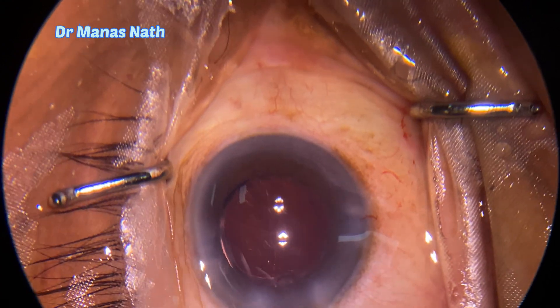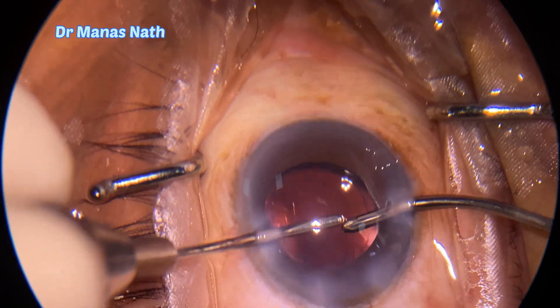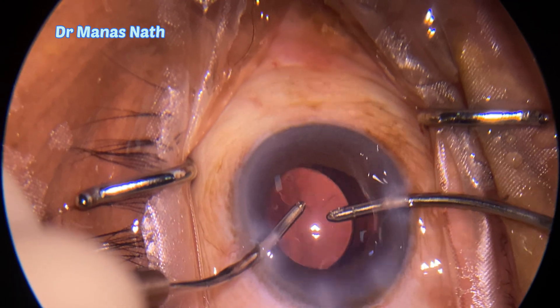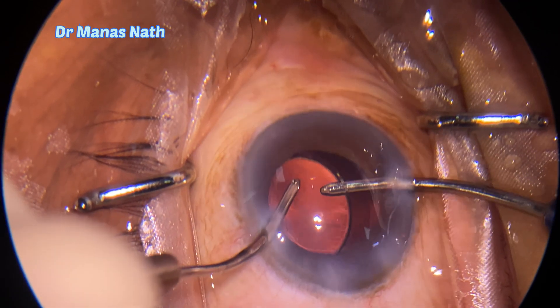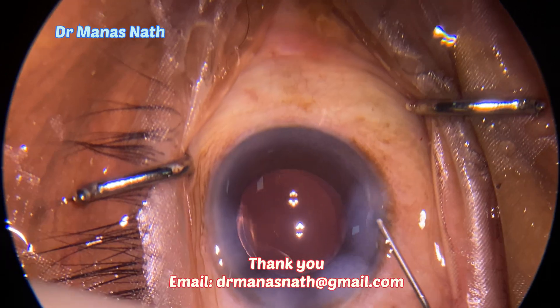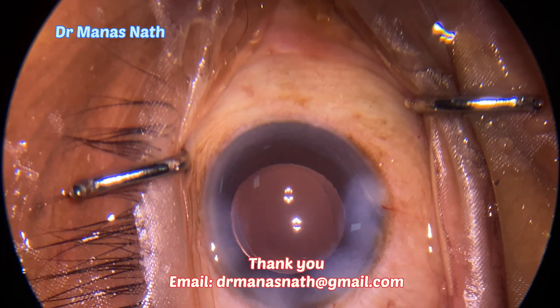Now before initiating the viscoelastic removal, hydrating the ports, going below the IOL to remove viscoelastics from inside the bag. The chamber is now well formed. Thank you.